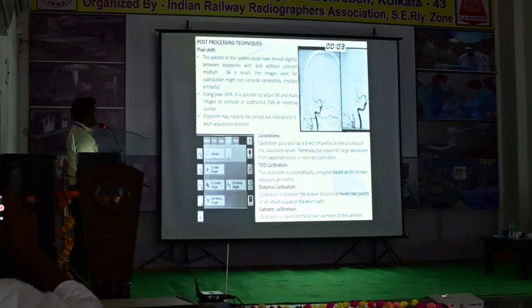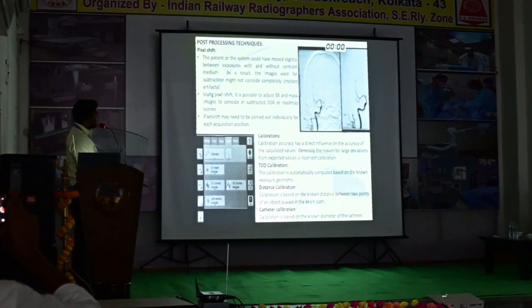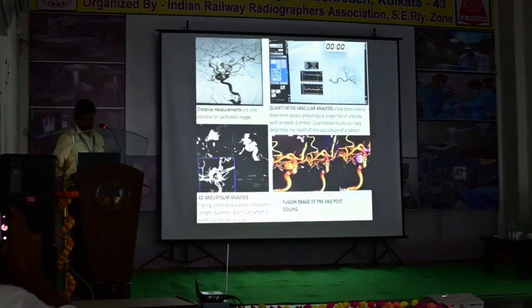This artifact is a motion artifact, which can be corrected with pixel shift. Pixel shift can be applied as a correction in the applications. Calibration is very important for the post-processing techniques. If calibration is done perfectly, our post-processing details will be more accurate.